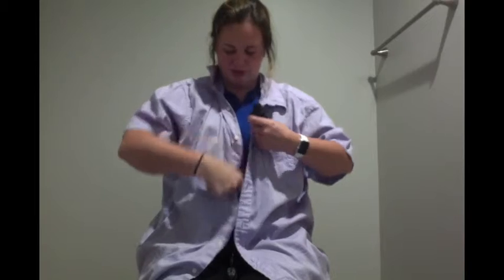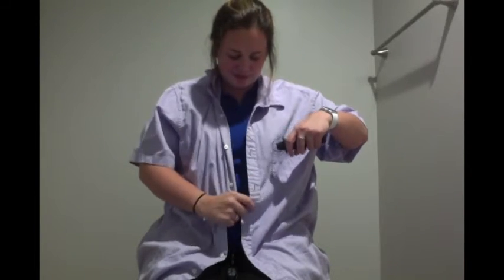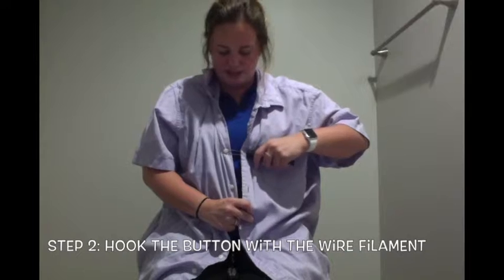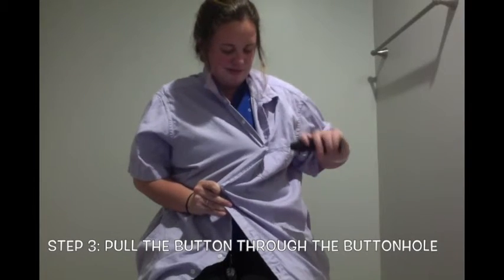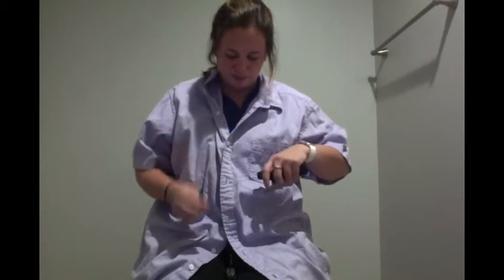So let's get started. I'm going to stick this through the hole and going over, using the big part, I'm going to put it around my button and I'm going to pull and twist until it's through. Then I'm going to repeat that until my whole entire shirt is buttoned.